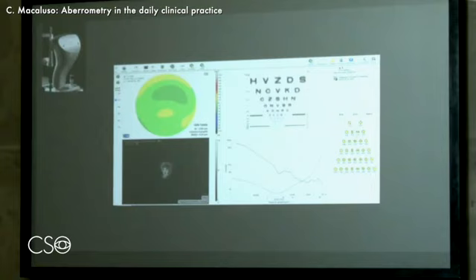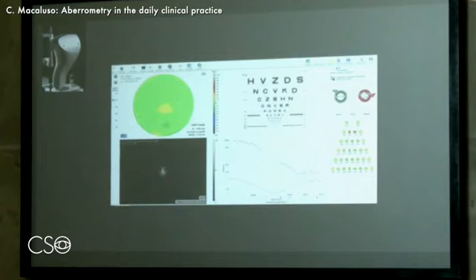With a keratoconus that is not so advanced, we can get better results just without correction. With correction of sphere and cylinder, we get an even better result, but still you see the effect of the coma and the other aberrations. And if we correct them, we see how well the acuity can improve.